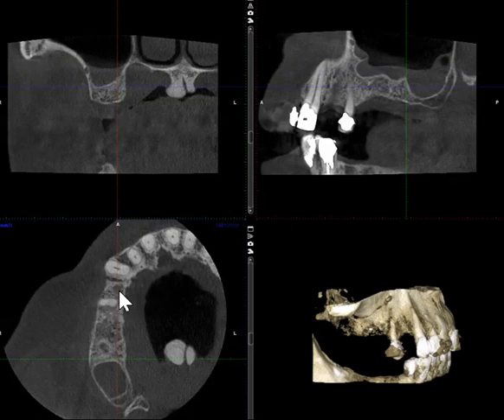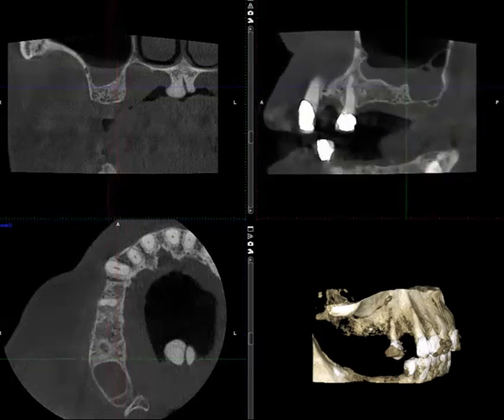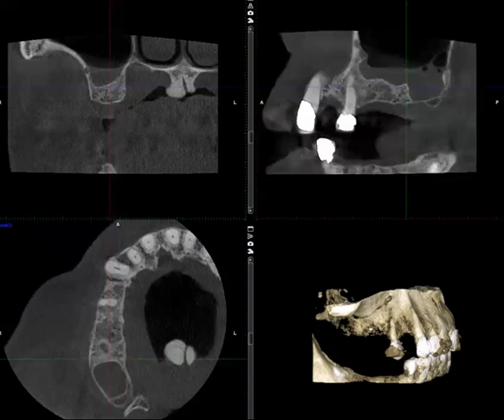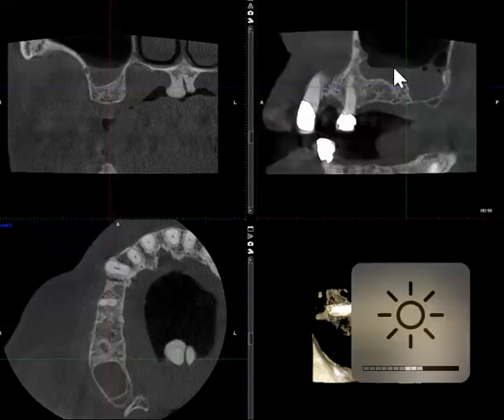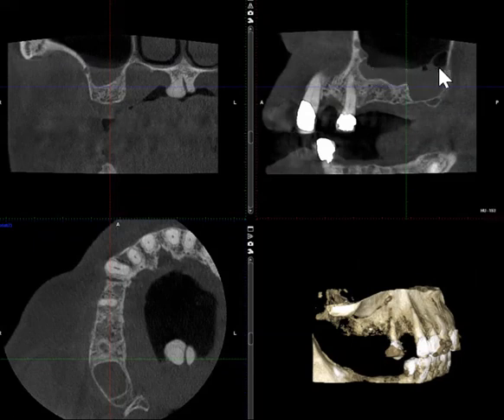However, while assessing this volume I found that the maxillary sinus was partially opacified, and this opacification is unique from many other types of opacities that I may have shared in prior videos. You can see that there is a very flat horizontal line across the maxillary sinus.